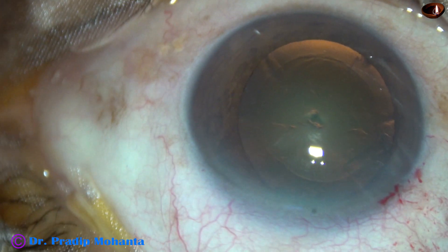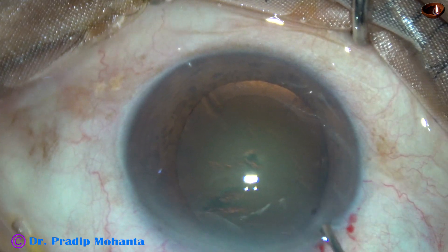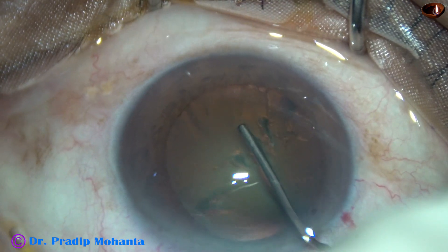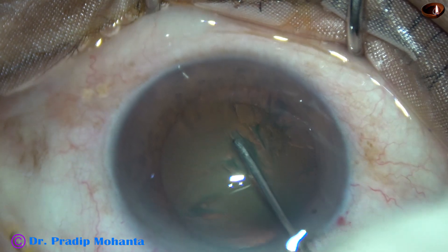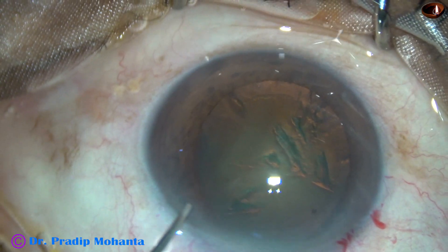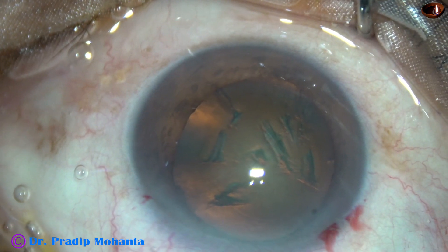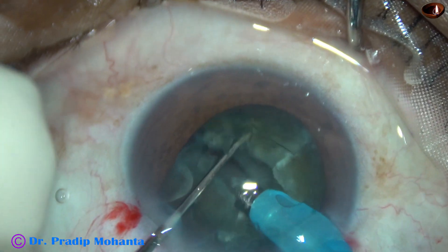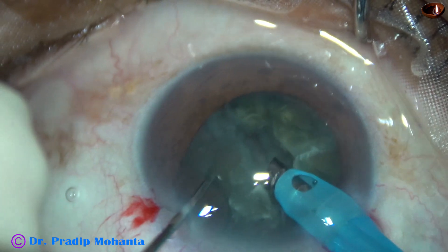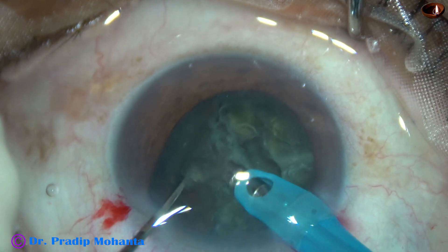And now see what happens as I do hydrodissection. As I do hydrodissection, you find that the nucleus refuses to rotate. There is too much resistance and it is not rotating. However, it is rotated ultimately with bimanual maneuvers.